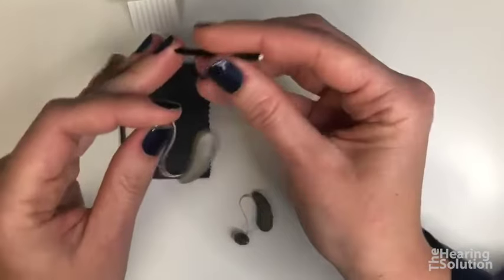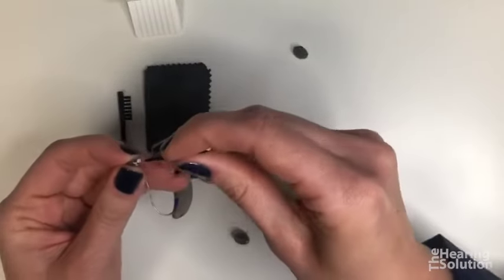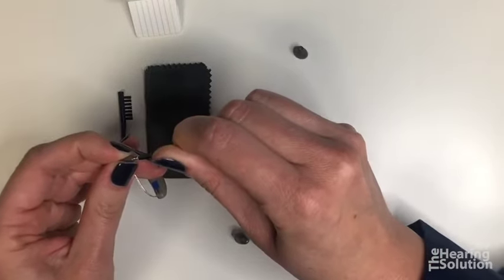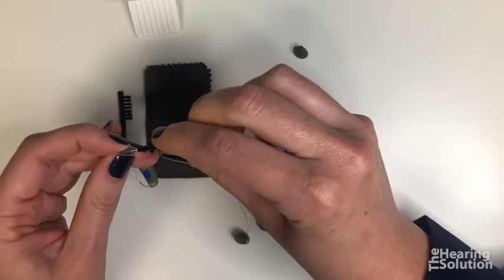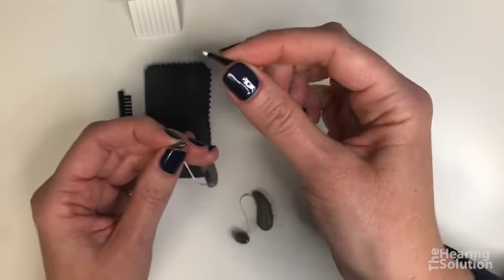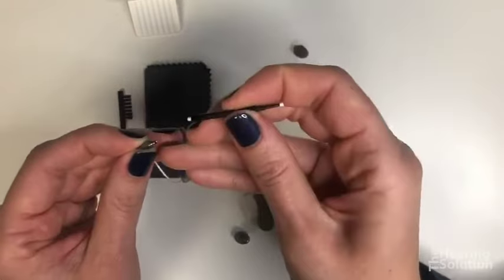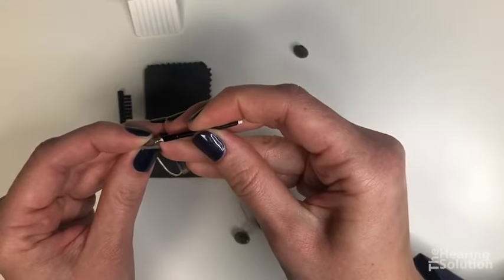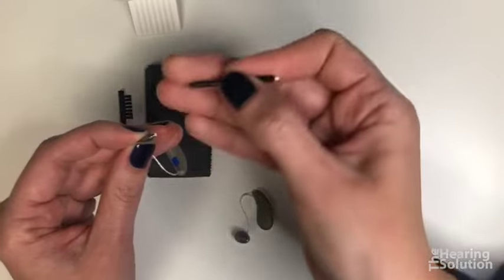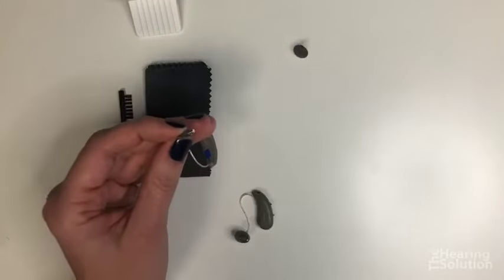So when you take the black part, you're just going to screw it into your dirty filter. You have to screw it pretty hard. Use some force, you won't hurt it. Pull, and it'll pull that dirty wax filter out. You're going to flip over your stick and push the new filter straight in, and it'll just stay like that. And then throw your dirty stick away. So it's a one-time use.